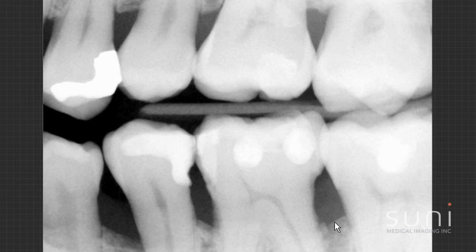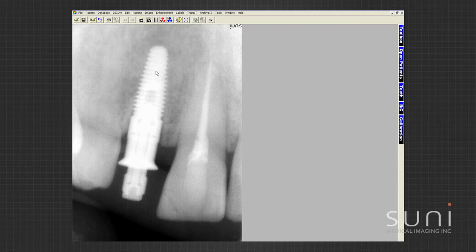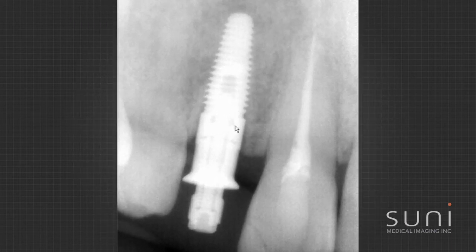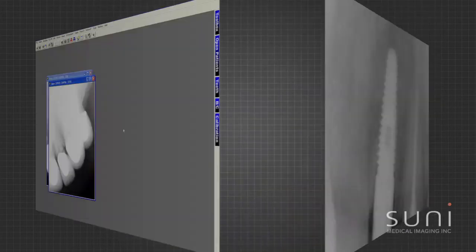On traditional bitewings this is an implant case. I've placed my implant and now I'm looking to see that the implant head and neck is at the level of bone that I want it to be, and that the bottom of the implant is at the bottom of the hole that I drilled. It looks like it's screwed in really well — everything looks nice. Clear, great image quality for implants.